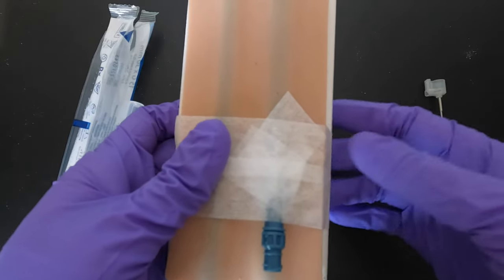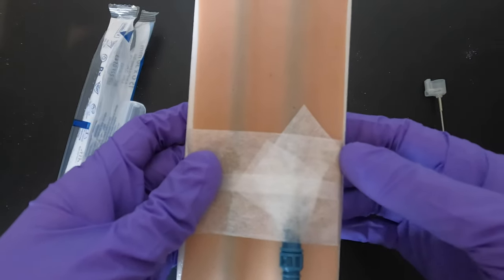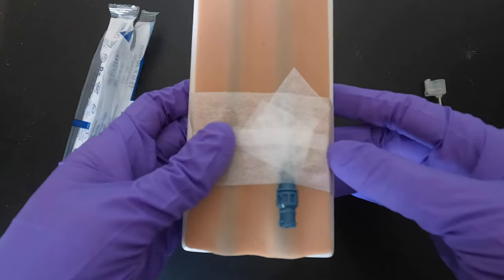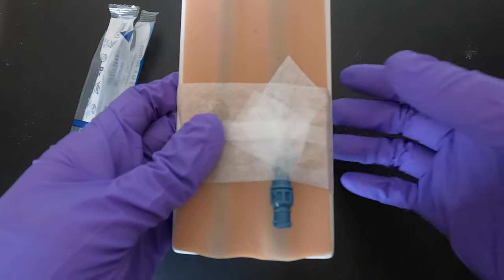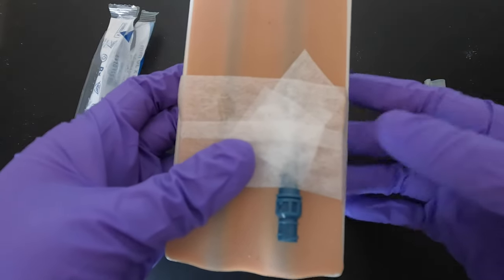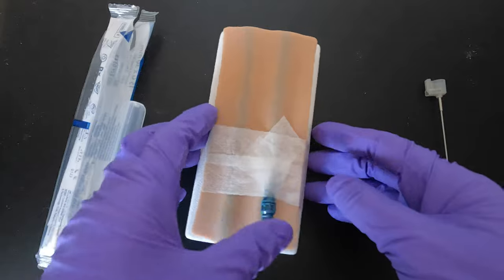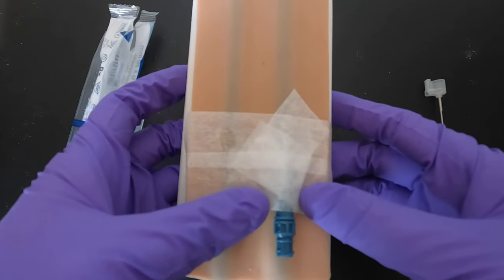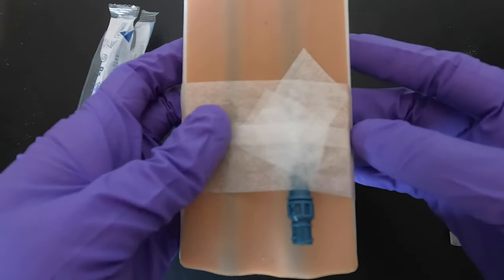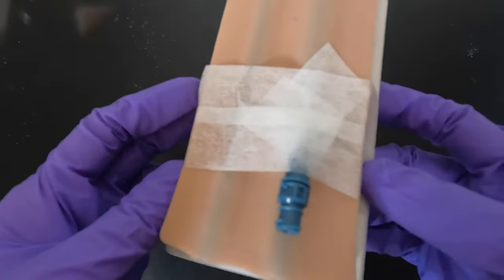With this type of needle, the patient can actually move freely compared to the steel one. I've seen patients having meals using both arms, doing crochet during dialysis, or using their phones. It can still sometimes increase the pressure on the machine if they bend the arm at 90 degrees or raise it higher than usual. But basically, patients have more freedom because what's inside the vein is plastic, not a needle.